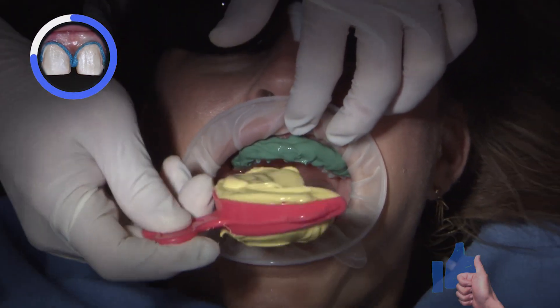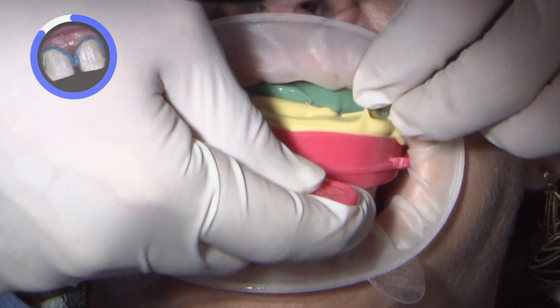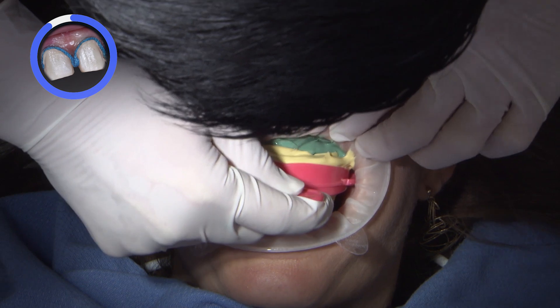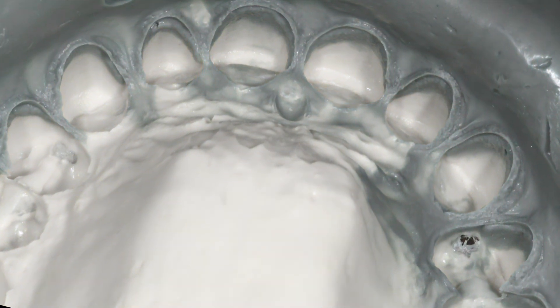Once the light body has been applied, I'll now slowly adapt the anterior triple tray filled with heavy body material to the preps. Once the impression has been taken, we'll then get the patient ready for their provisional restorations.